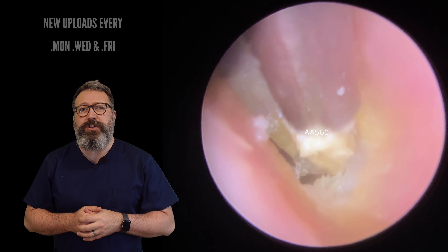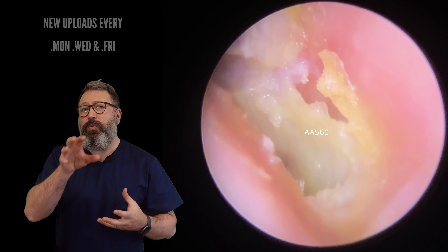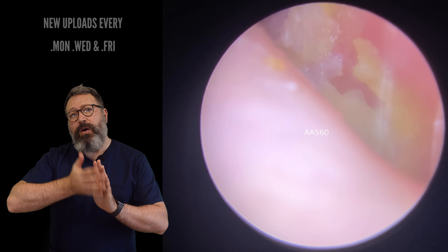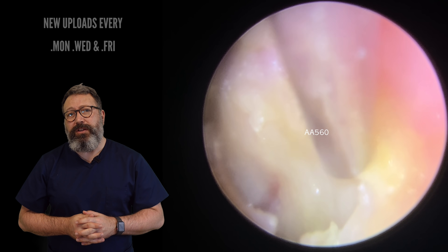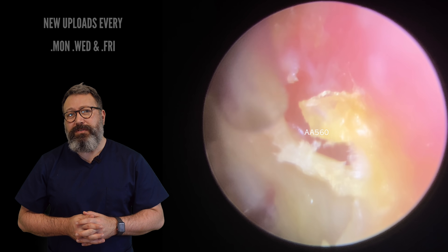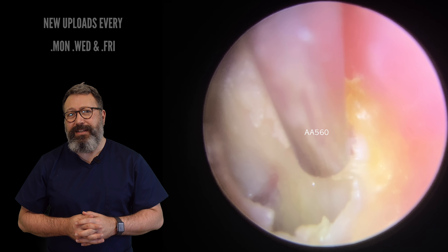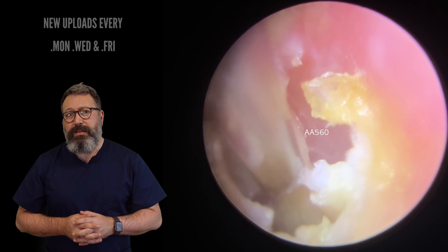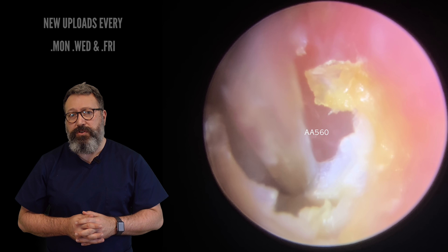What I'm doing here is very gently hovering over these bits of dead skin and taking this away. Now what you can see there is actually the eardrum, and you can see that white layer that's built up on there. Watch as we start to peel this away and you'll understand what we're talking about — that layer there is actually built up on the drum itself. You can see it's just flexing a little bit, so we've got to be really cautious here.